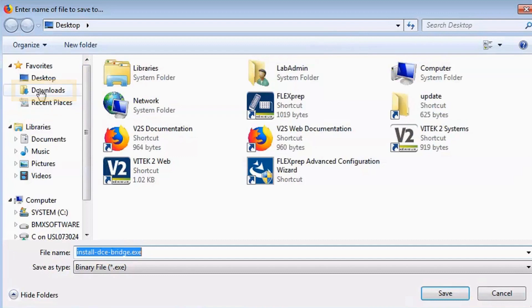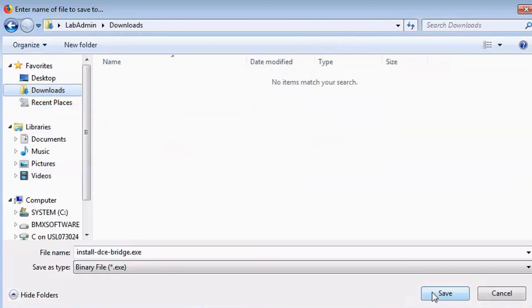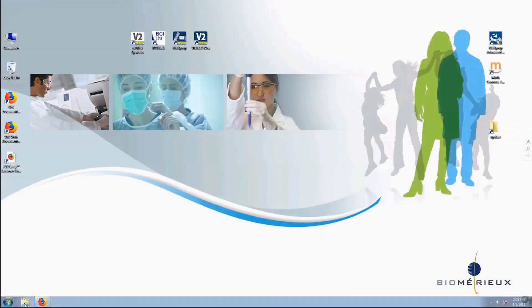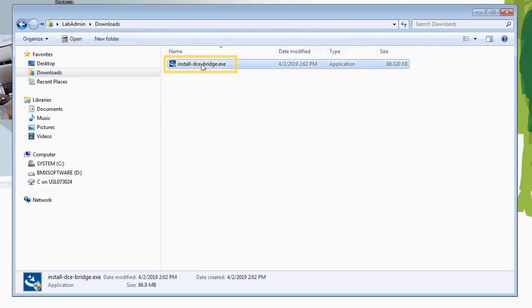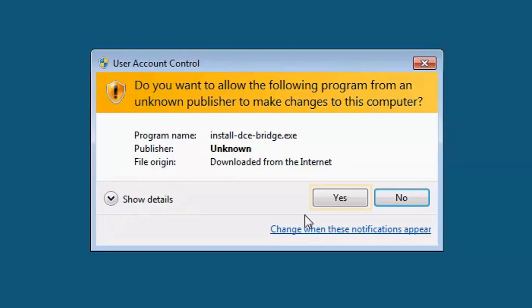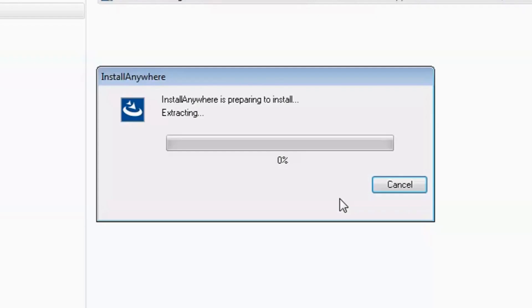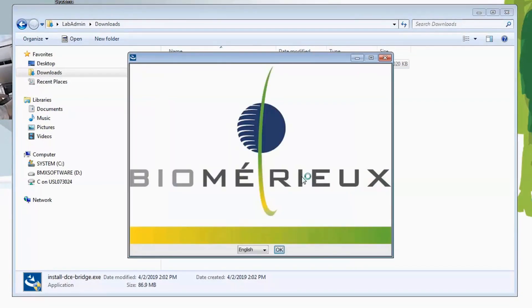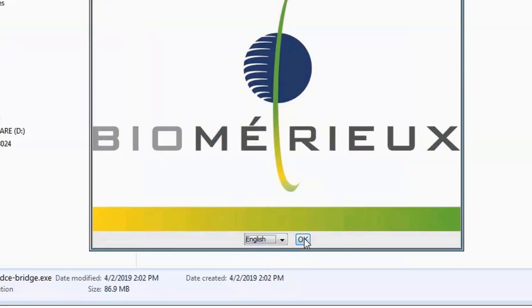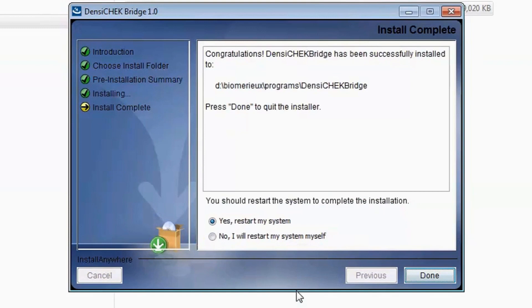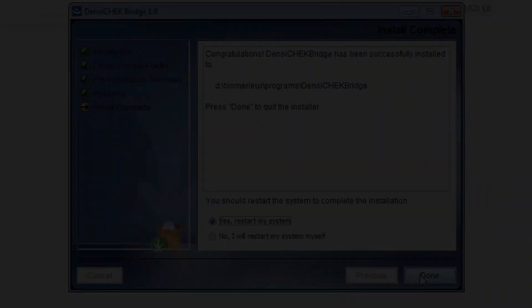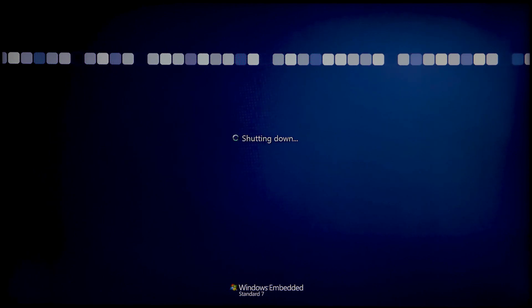The file will download into the Downloads folder. Navigate to the Downloads folder. Locate the Install DCE Bridge file and double-click it to execute the file installation. If the User Account Control warning appears, click Yes. Select your corresponding language from the drop-down and click OK. The Densichek Bridge 1.0 Install Wizard launches. When the 'Congratulations, Densichek Bridge has been successfully installed' message appears, keep the default setting with Yes, Restart my system pre-selected, and click Done. If the computer does not restart automatically, restart the computer from the desktop to complete the install.